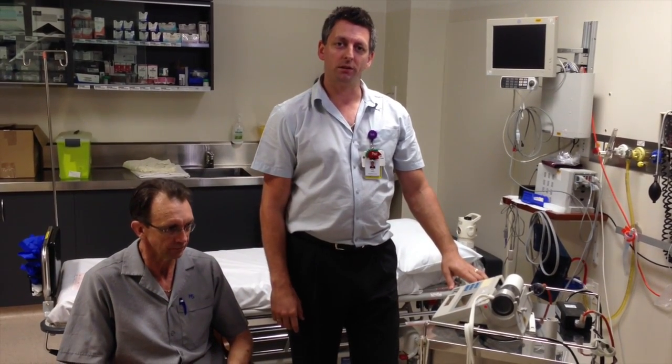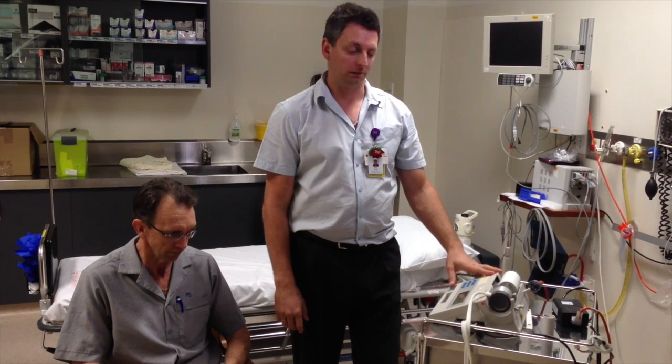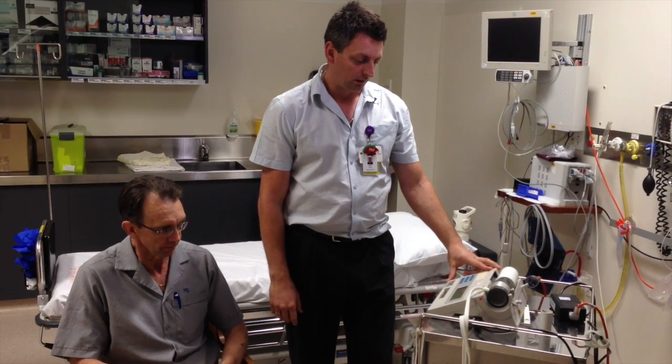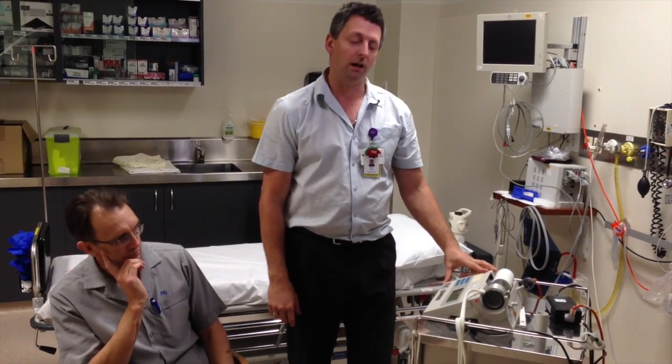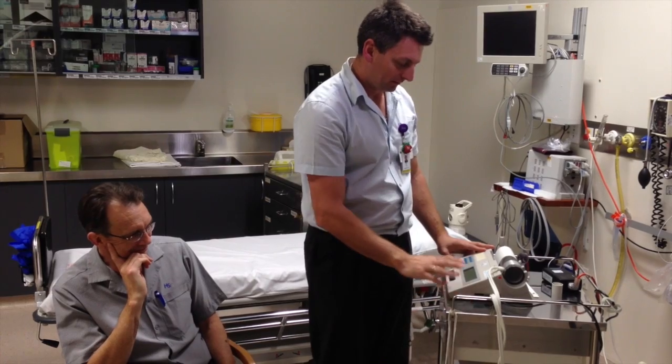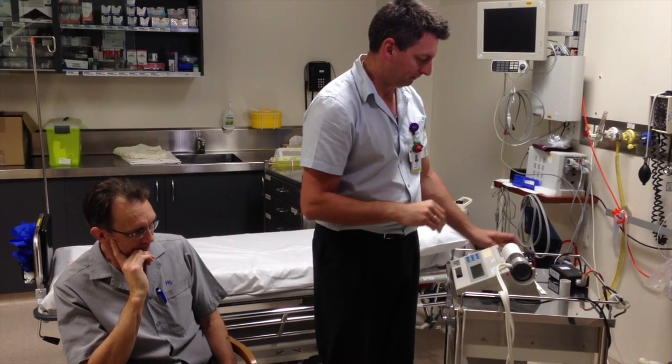Welcome to QNOW videos. Today I'm going to show you how to do a spirometry on the old vitalograph. This is invented just after the Second World War — not really — but it is that old and it still works well. I love it. I prefer this one to the other one.